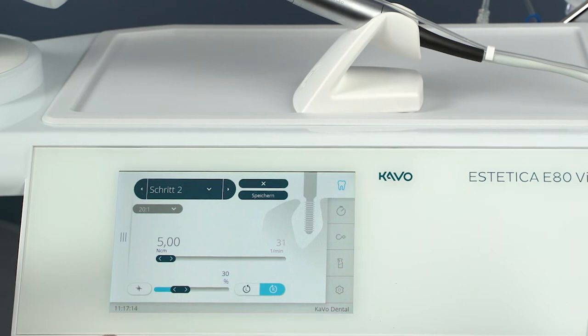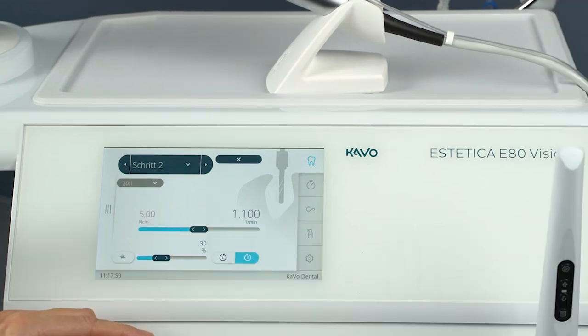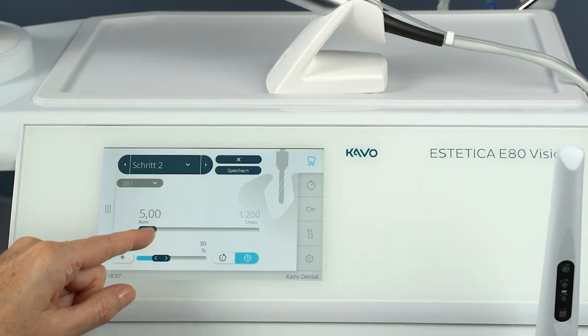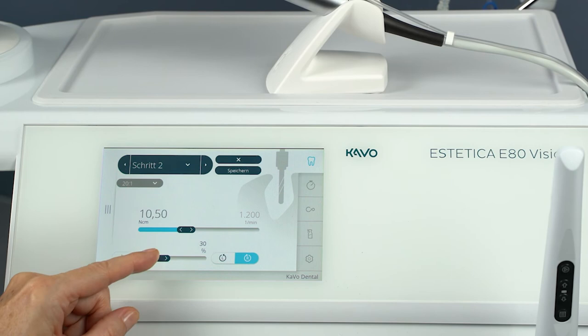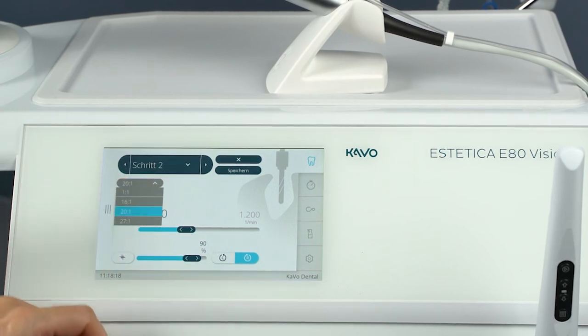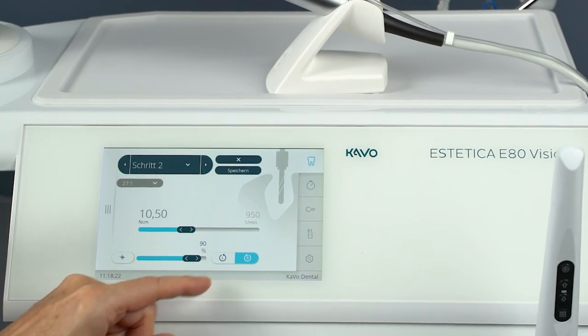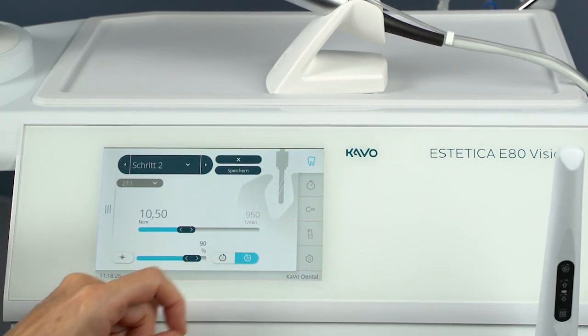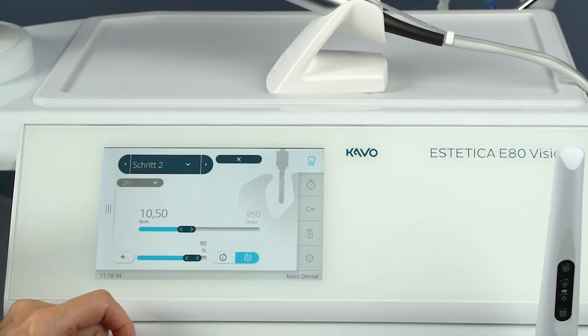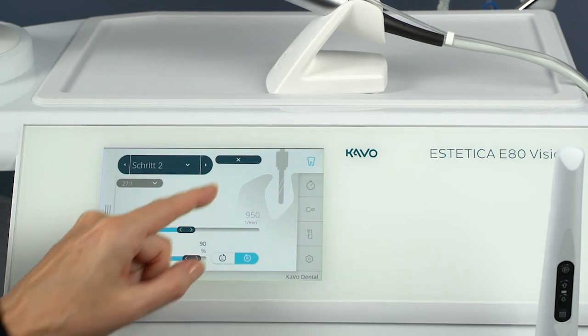The values preset in a program step are default values to enable immediate work. Changed values can be saved and are thus available again for the next application. You can adjust the speed and torque parameters using the slider. The coolant flow rate can also be set using a slider control. The transmission factor can be selected from the respective list. To switch between clockwise and anti-clockwise rotation, tap the direction of motor rotation button. To save the parameters, tap Save. The changed parameters are saved in the selected parameter storage locations. To leave the menu without saving, tap Cancel.